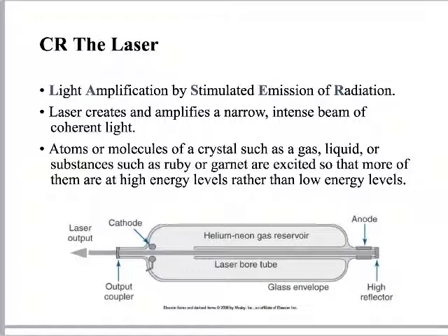So that laser is really, really important. Laser is an acronym, actually. It means light amplification by stimulated emission of radiation, right? What kind of radiation? Well, it's not ionizing radiation. It's high-powered light. It's very focused light radiation. It's very powerful, though. If you've seen lasers used in surgery and stuff like that, you know how powerful a laser can be.